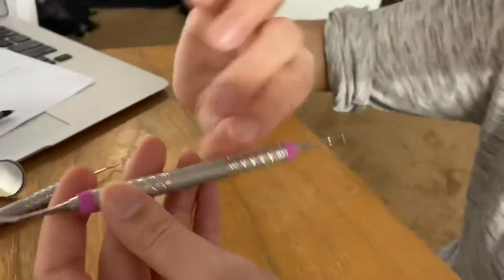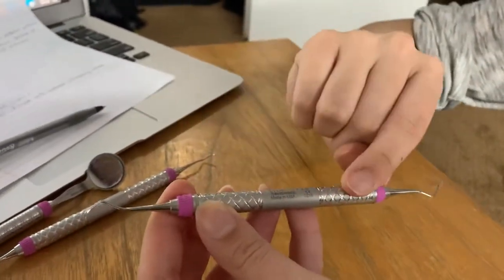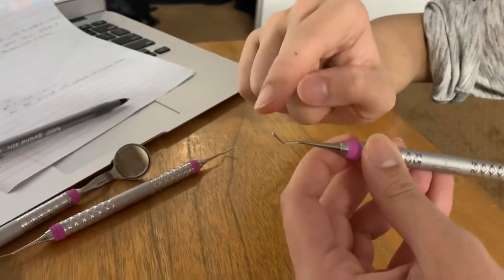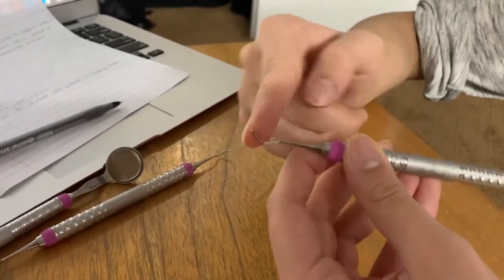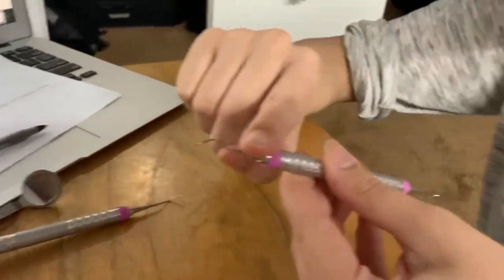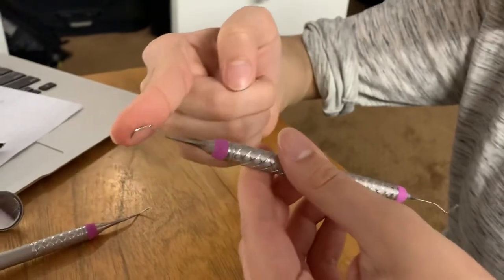I'll describe the parts of these instruments. We have the handle right over here. These are the shanks of the instrument, and these right here — what we'll be using on the tooth — is the working end. Same thing goes for this one: we have the handle, we have the shank, and then we have the working ends right over here.